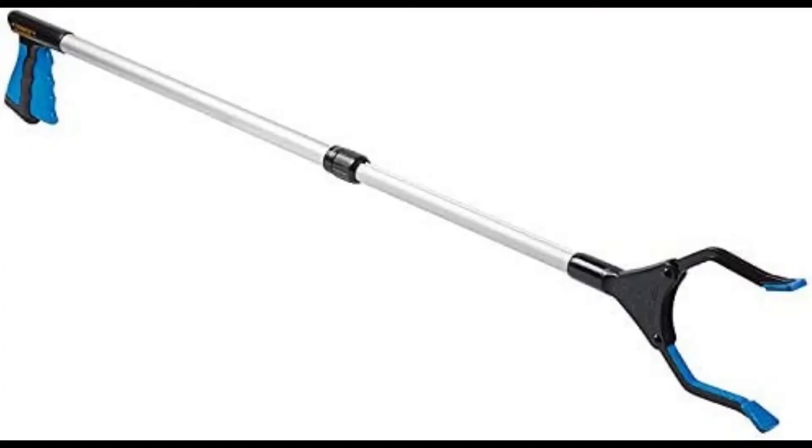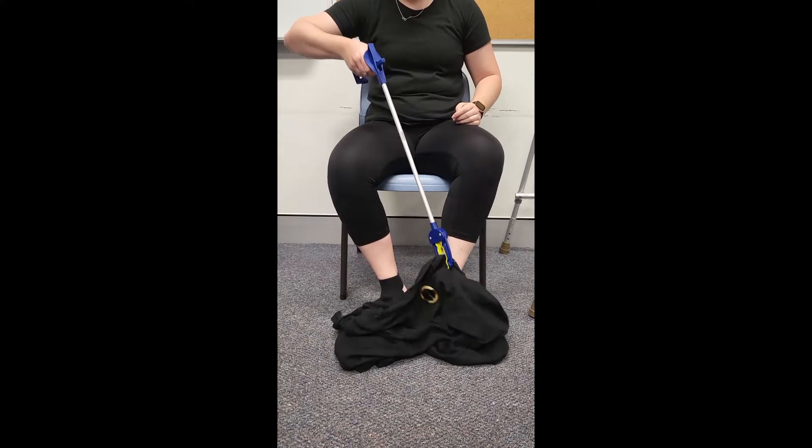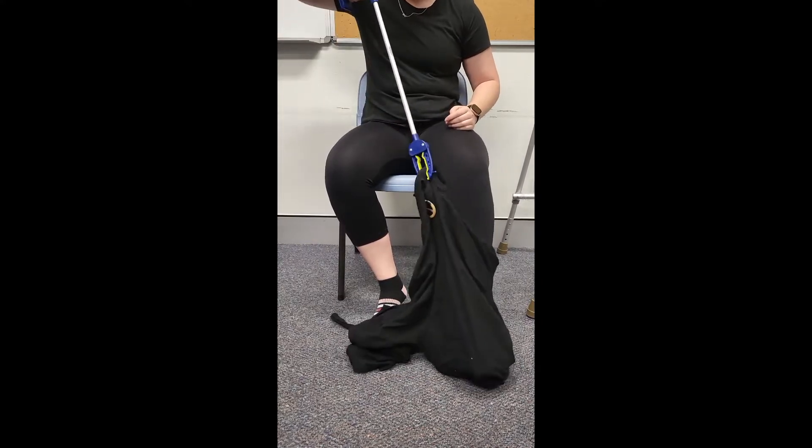A long-handled reacher is a piece of assistive technology that can assist with dressing tasks. This device can be used to help compensate for limitations surrounding the ability to bend forward, enabling a person to reach clothing from the floor and complete lower body dressing tasks. A long-handled reacher is often included in a hip kit to assist with completing dressing tasks whilst adhering to hip precautions following a hip replacement. This video demonstrates how to use a long-handled reacher to don pants following a total hip replacement.